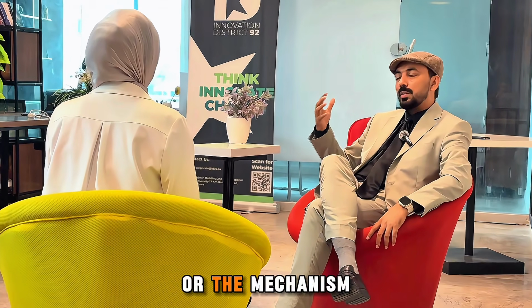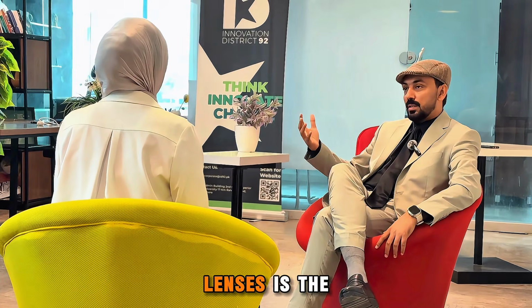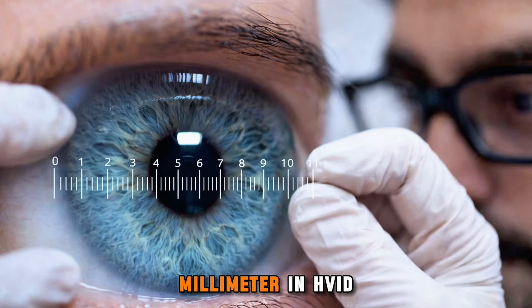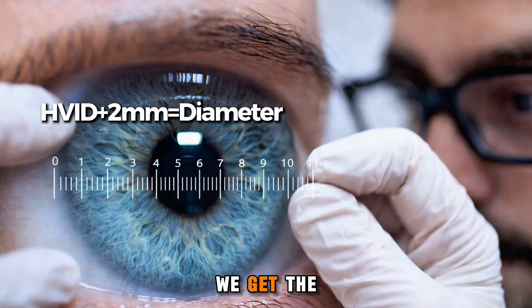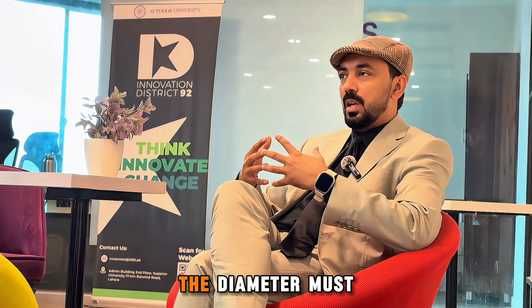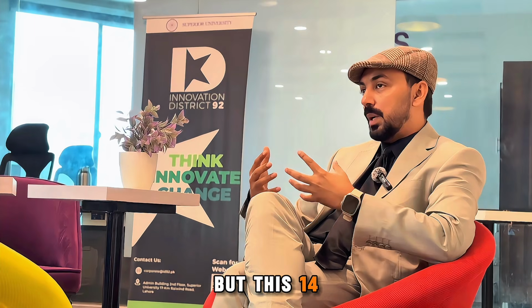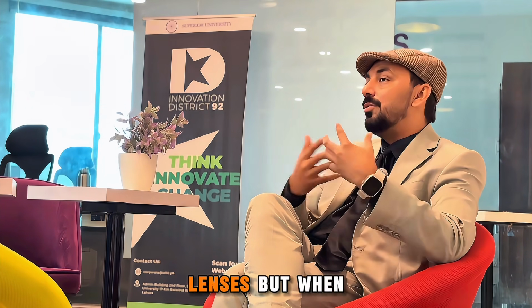Kashmala, the criteria or mechanism for selecting the diameter and the base curve in spherical soft contact lenses and toric contact lenses is the same, but with a little change. For selection of diameter, as you know, we add 2 millimeter to the HVID and we get the total diameter. But in case of toric soft contact lenses, the diameter must be a little bit bigger than the HVID plus 2 mm. For example, if HVID is 12 mm, we add 2 mm and the result will be 14 mm. But this 14 mm is the total diameter in soft spherical lenses.